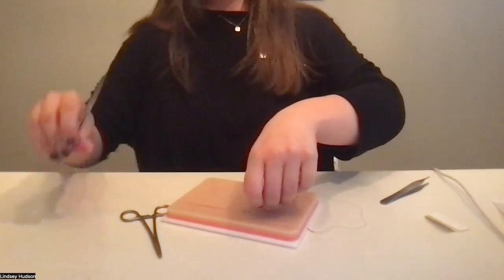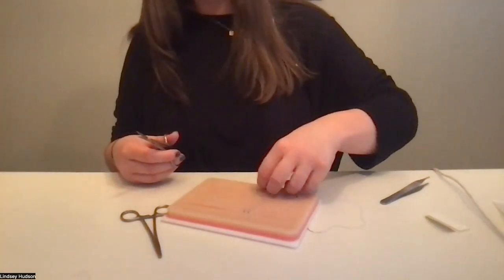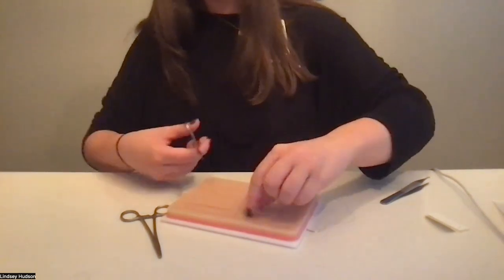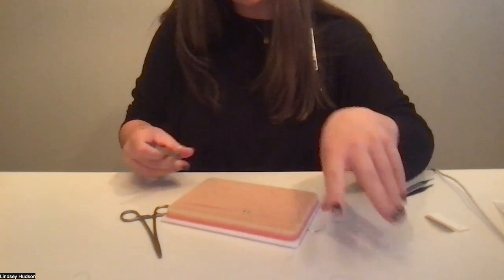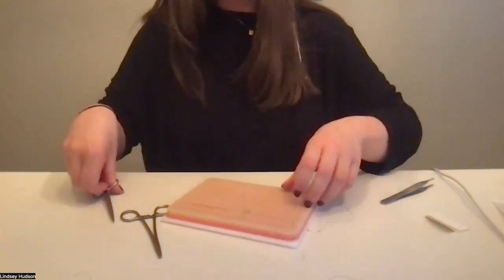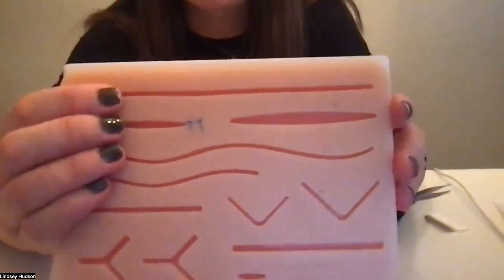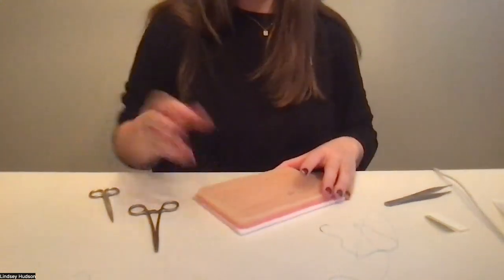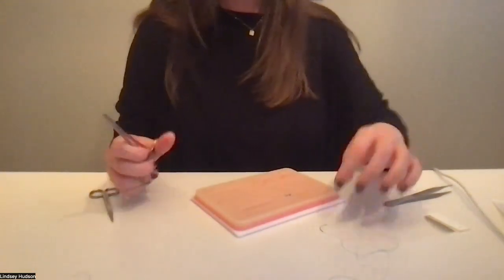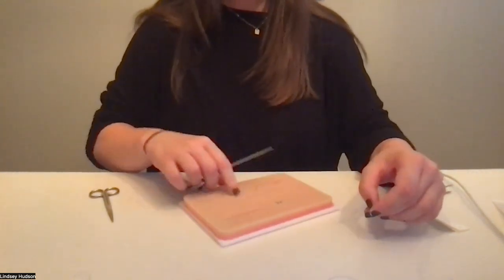Again, take your scissors, cut at an angle, so they're the same length. And you'll notice that both of these sutures, the knot is on the same side. That's important to keep them on the same side, just so that the sutures don't look, for lack of a better word, ugly for the patient. You want them to look as good as you possibly can.